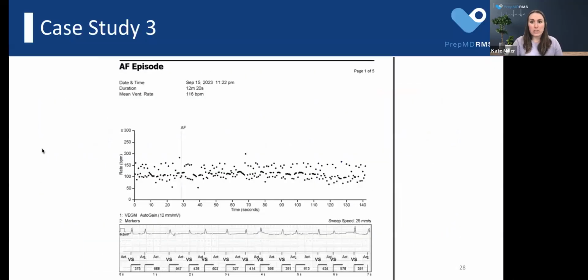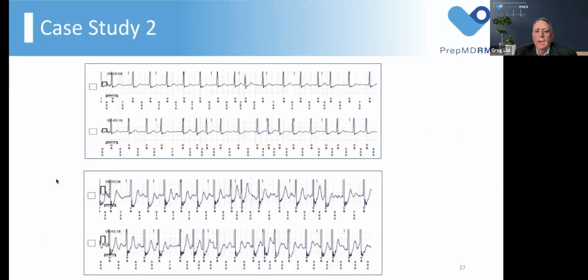Great. So let's go on to case study number 3. Kate, as you move into 3, quick question here. I know we brought up twice that we've got 2 scenarios where patients were escalated and we got them on oral anticoagulants. For Shannon and Tammy, how do you normally communicate with your clinics? Shannon, if you were working in the clinic, you immediately had access to make things happen for getting the right changes for the patient. Now you're remotely removed, providing these services. Maybe share with the group how you communicate with your clinics and let them know when they have actionable items.